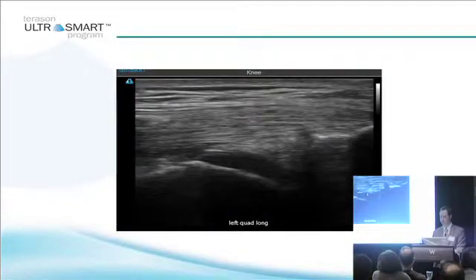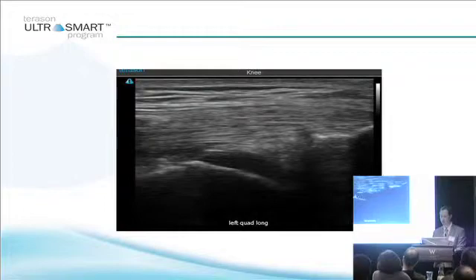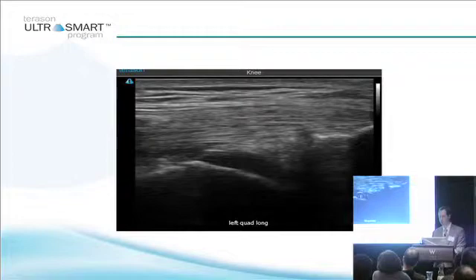However, if the knee is bent and you've got that quadriceps tendon here, now you've got this hypoechoic area. This is not intra-articular fluid — this is articular cartilage. So don't stick a needle into someone's articular cartilage thinking it's fluid.